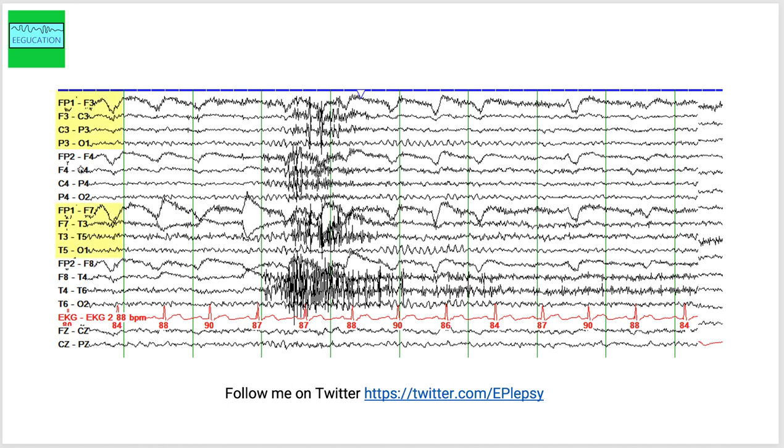Channels that end with an even number are recording from the right side of the brain and channels that end with the letter Z are recording from the midline.